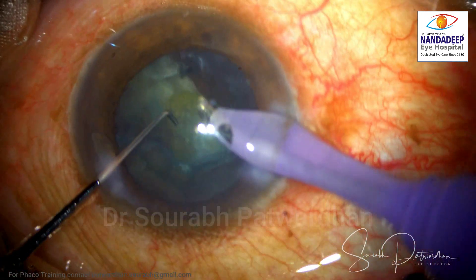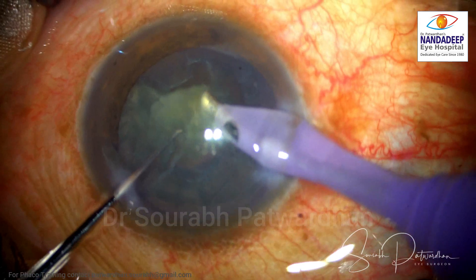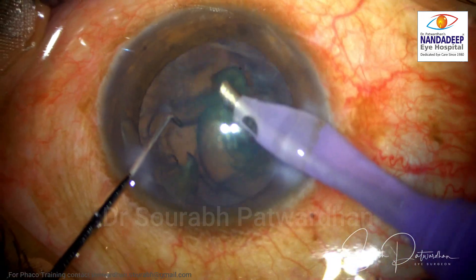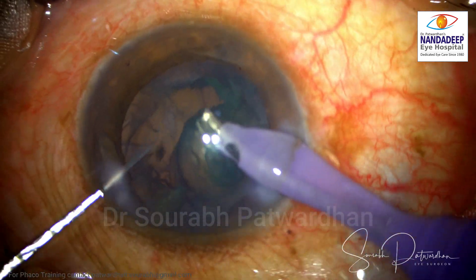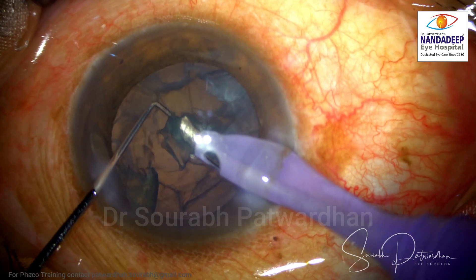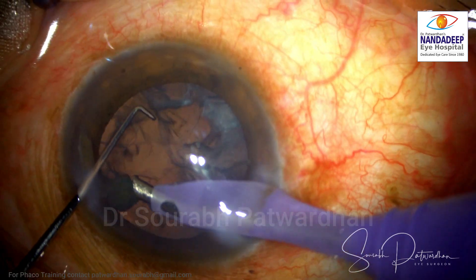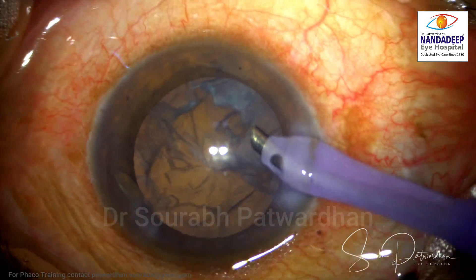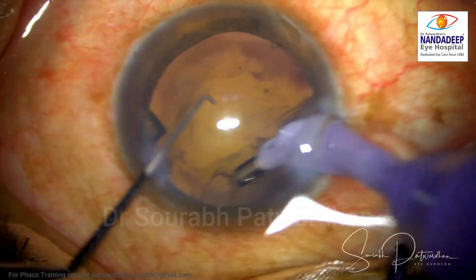Of course, if you do hydrodissection properly, it's much easier than not doing hydrodissection in a routine case. So this is the end of the emulsification. Just take care that you divide the nucleus properly, and if required, we can always do hydrodissection in between to rotate the nucleus.